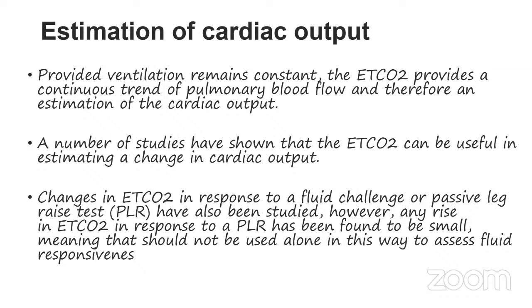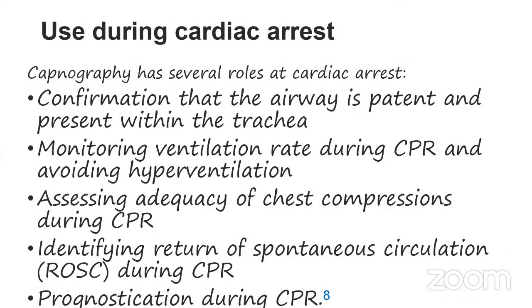However, that rise is very minimal, meaning that it should not be used alone. It can be used with cardiac output monitoring. It is also used during cardiopulmonary resuscitation because it shows the patency of the airway, the ventilation, the adequacy of the chest compression, and also the return of spontaneous circulation. And also we can prognosticate during the CPR.